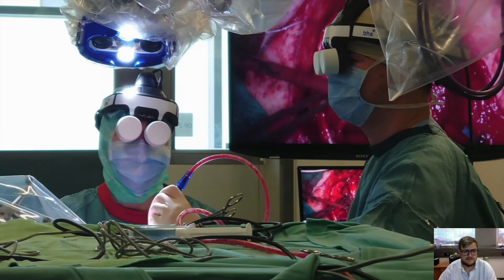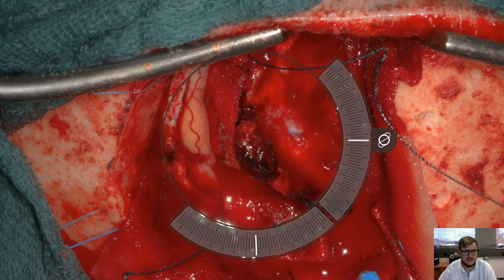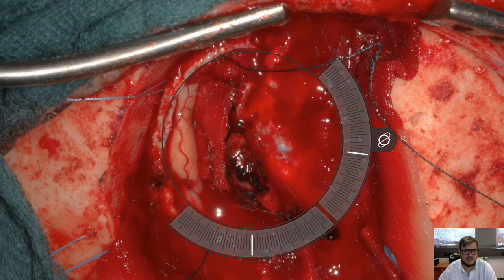Another cranial case was a parasagittal meningioma done by one of our residents. You can see her during the surgery and the assistant using a second head-mounted display. In the center you see the meningioma — the dural opening and parts of the lateral border exposed, with cottonoids already placed.